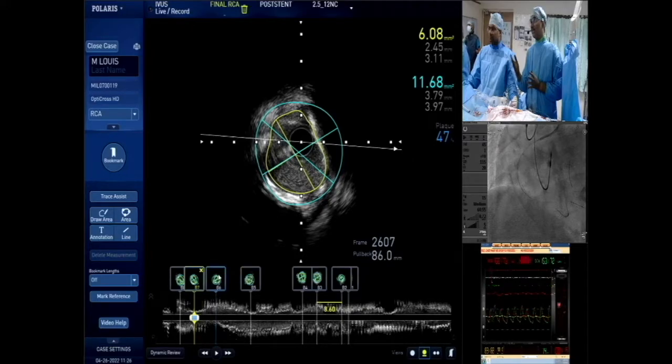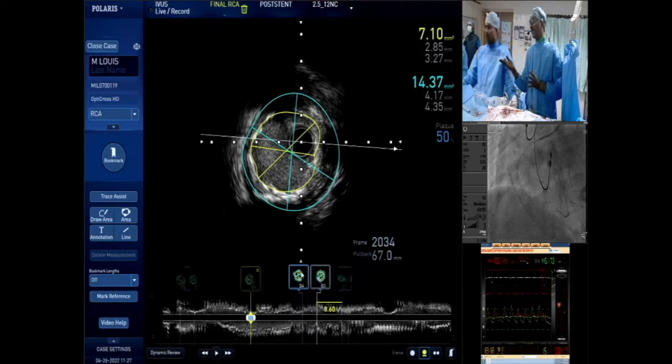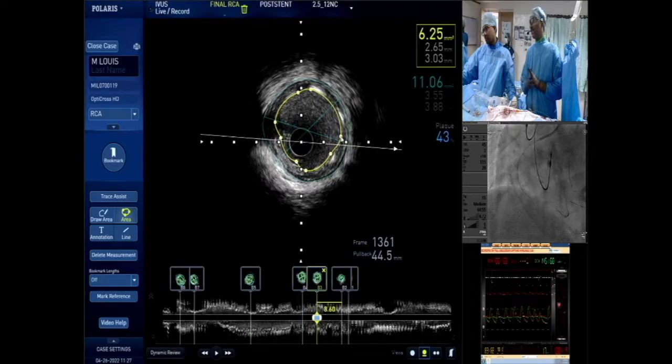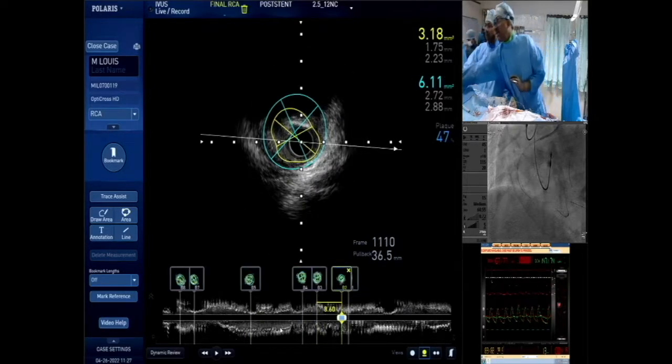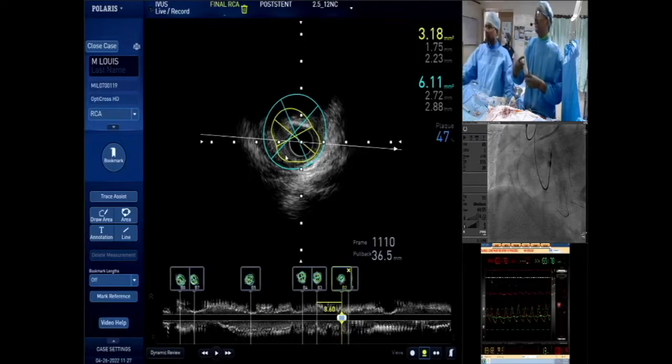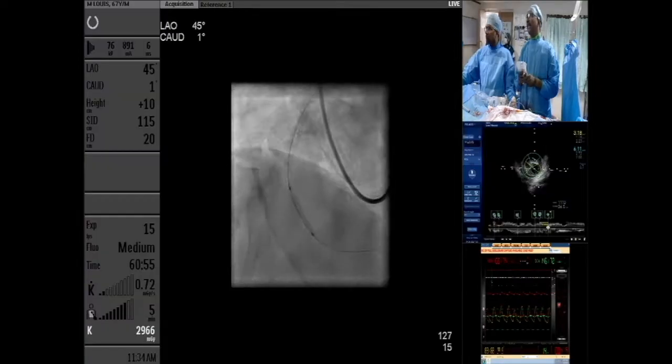Yeah, 6. Next. So more than 6 mm square, and in areas it is 7 mm square. So yeah, B2 please. Post stent, there was some lesion, you can see 3.1 is the area. That area we can see dilated with a 2.25 mm balloon up to 10 atmospheres.